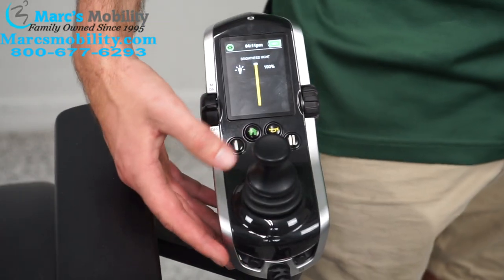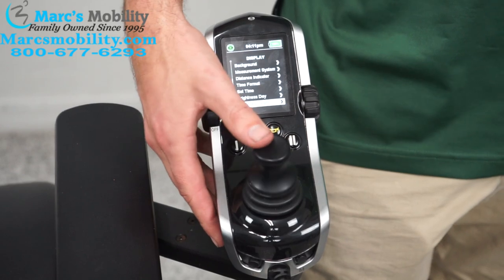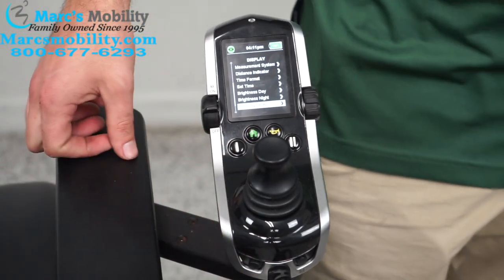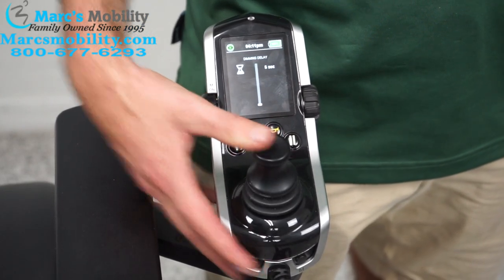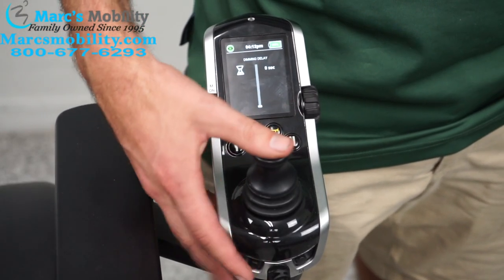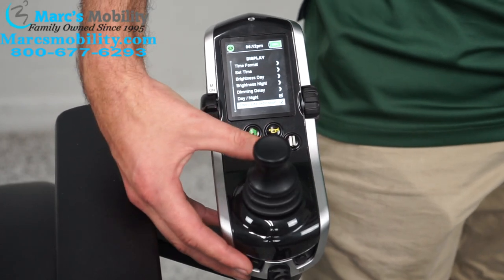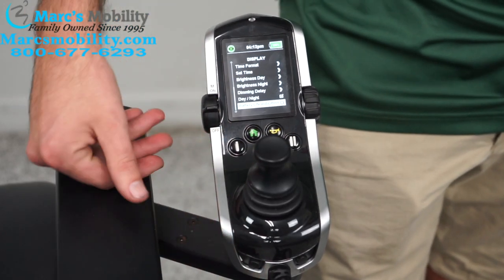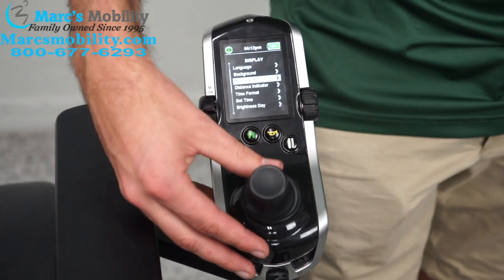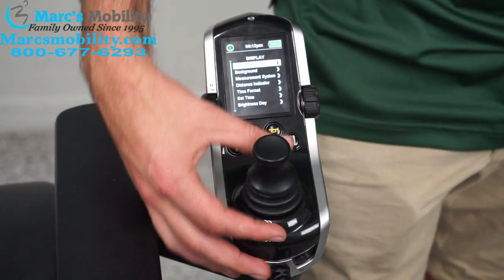Brightness night: if you want it a bit darker at night, set it to around 60% and push left to save. Dimming delay: how long before the chair starts dimming — I have it at zero seconds, but I can set it to five seconds so the display starts dimming after five seconds of inactivity, then I'll go back to zero. You can also enable or disable the day/night function by going right. Battery life indicator shows the percentage up top — you can disable it here, though I'm not sure why you'd want to.